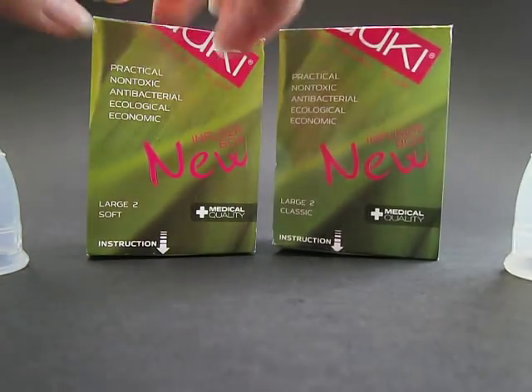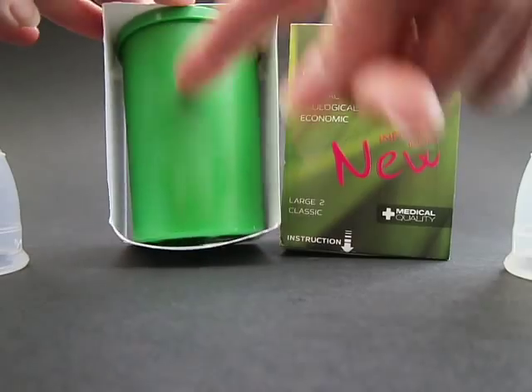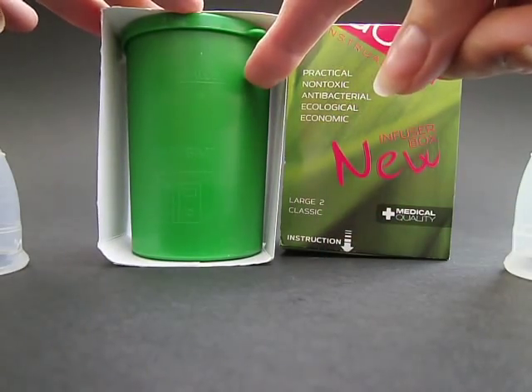They come in a box like this with instructions and the infuser box, so you can sterilize it in the microwave.